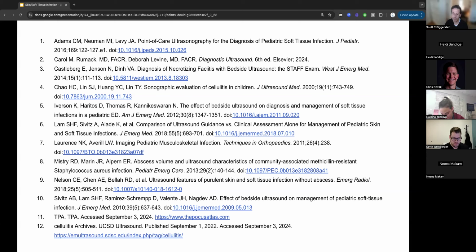I do not. I usually would avoid that and just use more clinical judgment and lean on the surgeons for their discretion as to whether or not the surgical site is infected. I don't think it would cause any harm as long as you're at least 24 to 48 hours out. At that point, I believe that incision is reepithelialized.